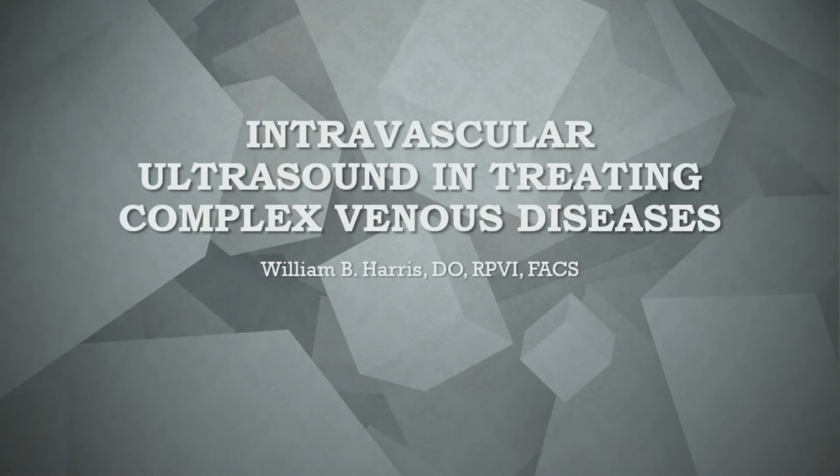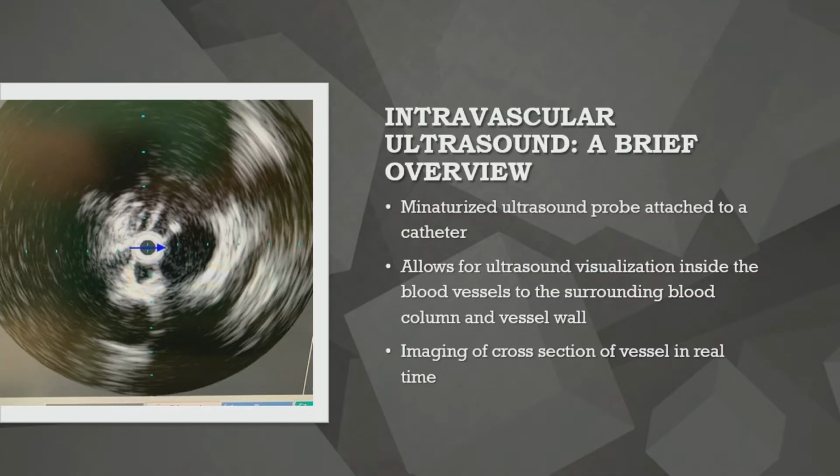So you can't treat venous disease without IVUS. IVUS is essential to treating venous disease. This is a really great picture. This is the iliac artery, and this is the catheter in the middle of the vein, and this sliver is the vein.